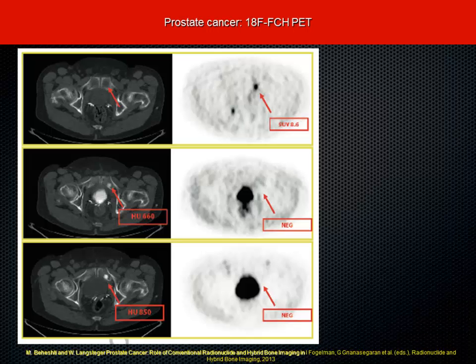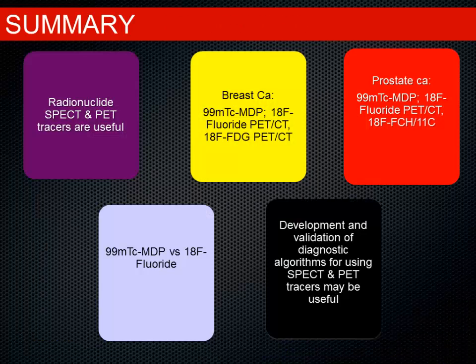And if you wait for a longer time, for example, if your Hounsfield unit is around 1,000 plus, you're not going to see it on any functional modalities, only on the anatomical modalities, because there is no viable tissue there, and the sclerosed bone is literally a concrete. There is no mechanism to induce an osteoblastic response in those areas. So you have to assess both scenarios.